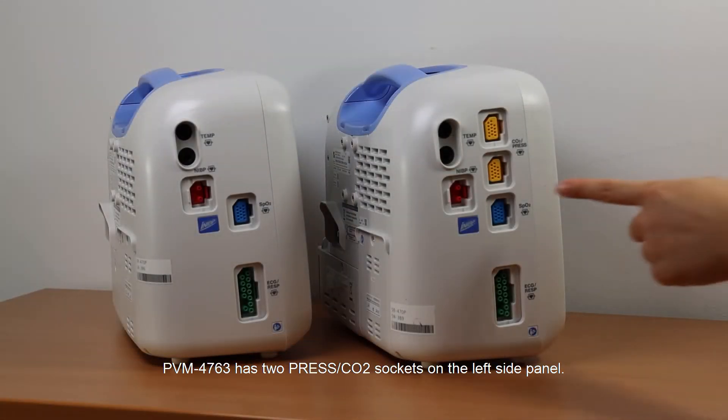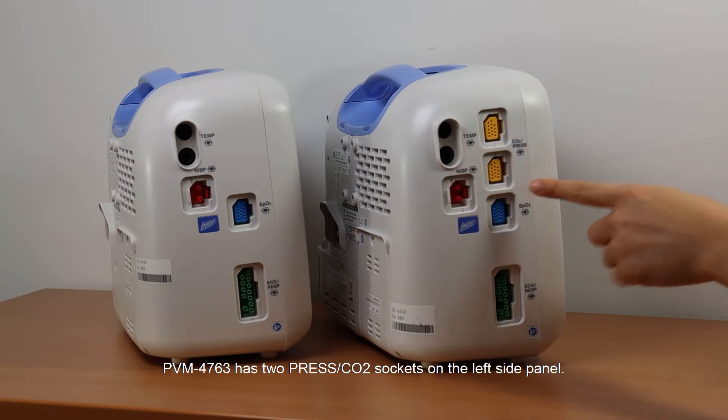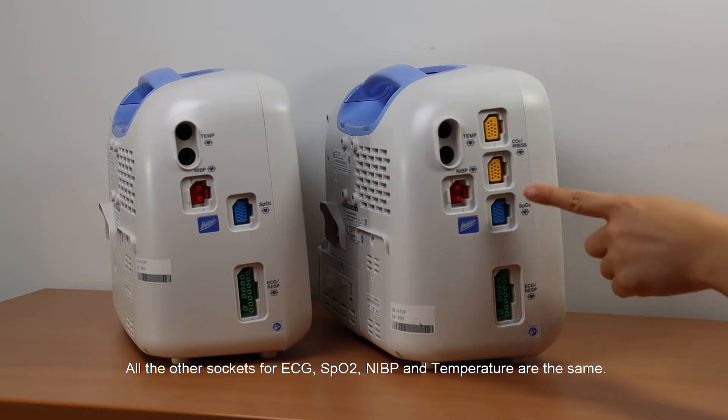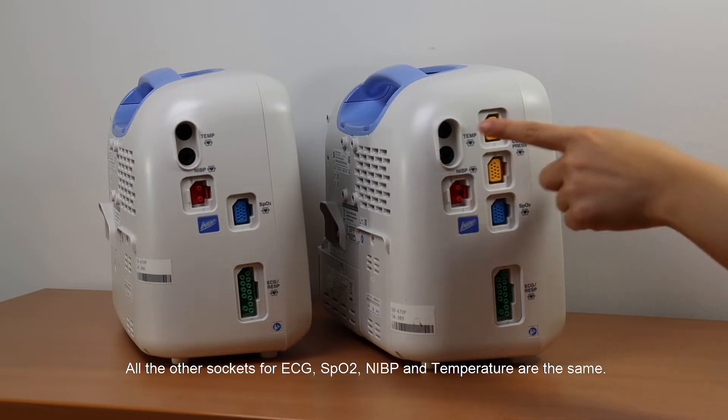PVM-4763 has two PRESS/CO2 sockets on the left side panel. All the other sockets for ECG, SpO2, NIBP, and temperature are the same.